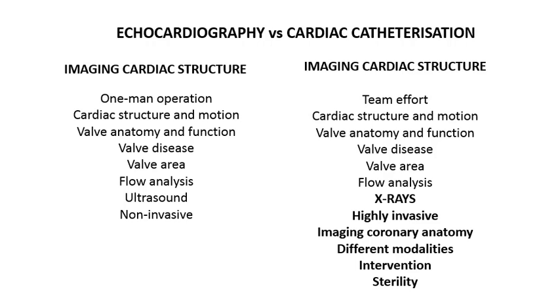Going through echocardiography first, it's a one-man operation. You're one-to-one with a patient, whereas the cath lab is a team effort involving cardiologists, nurses, techs, and a whole stack of other staff. We're both examining cardiac structure and motion on a live patient. We're focusing on valve anatomy and function to diagnose pathology, particularly valve disease and coronary artery disease. We both perform calculations such as valve areas, flow analysis, and cardiac output.